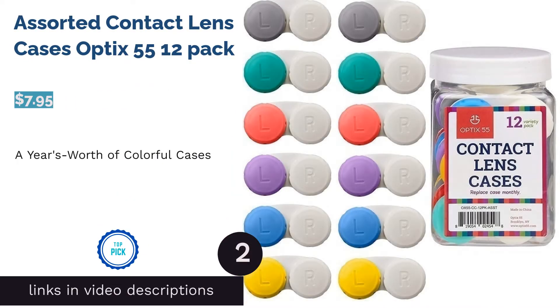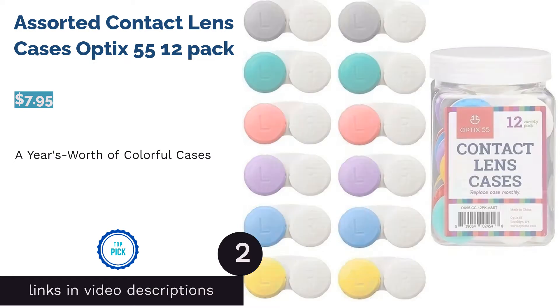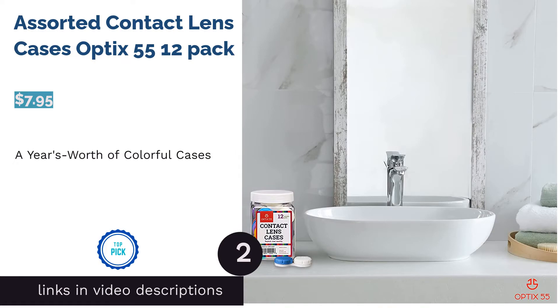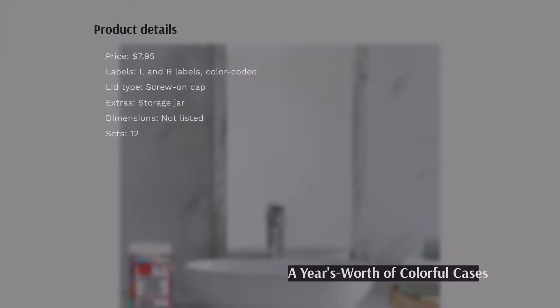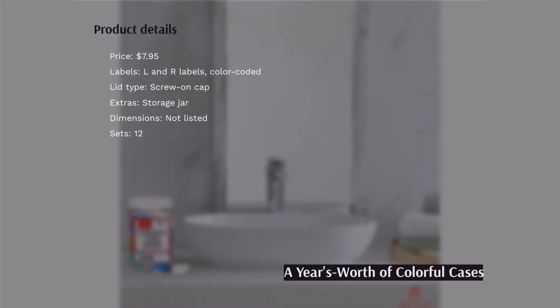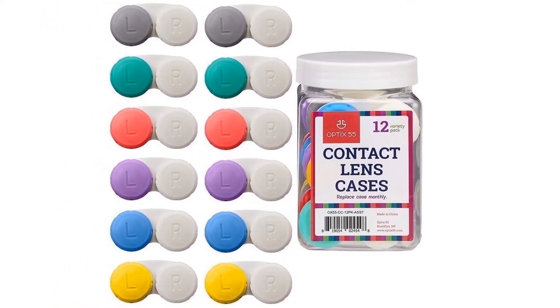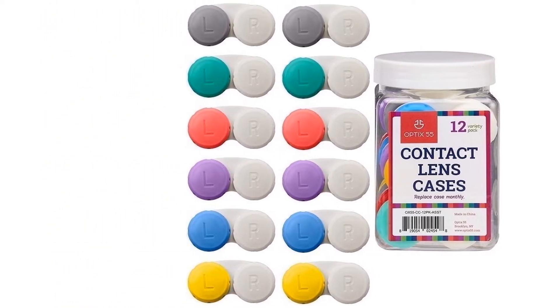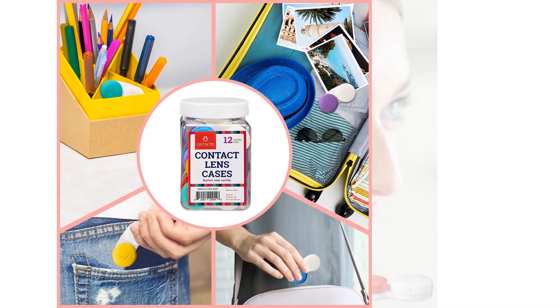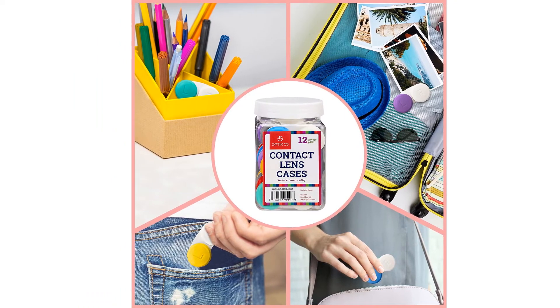The next product on our list is the Assorted Contact Lens Cases by Optics 55, a 12-pack. It's recommended that you change your contact lens case every month, and this contact lens jar gives you enough cases to change them every month for a whole year. Equipped with color-coded L and R labels, these cases are easy to work with. The screw-on lids are also designed to close securely.